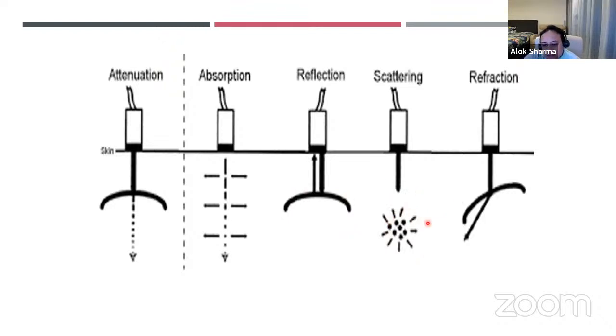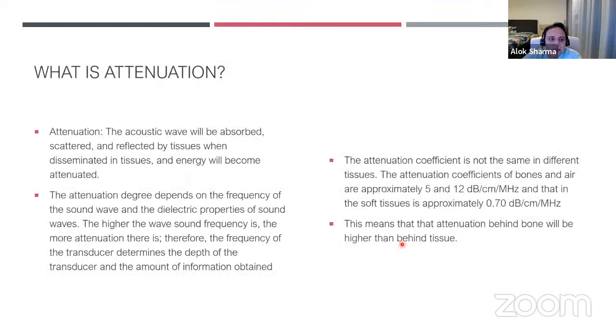Now, when you reflect in different directions, if you have fluid all the way around, you'll have reflections in between the fluid particles as well. This is basically what helps us generate B-lines. I'll talk about refraction a little bit later.